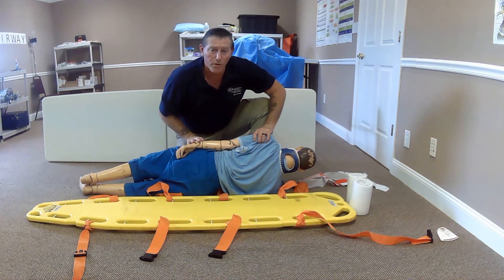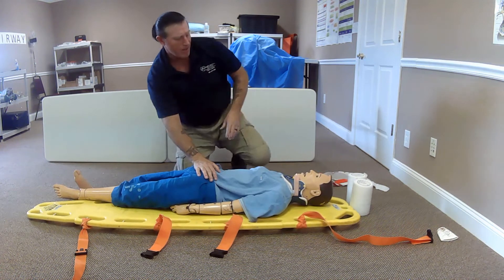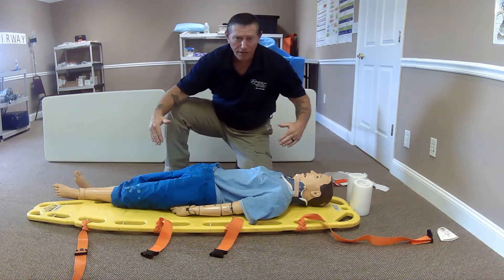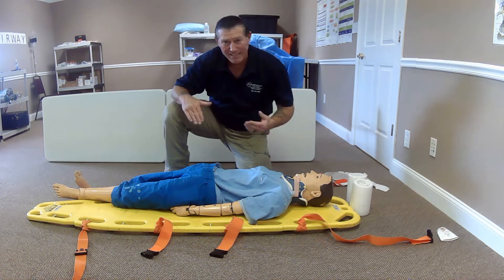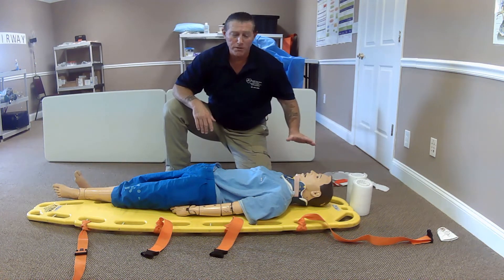I'm going to prepare and move my patient over to the board. Again, on the head person's count, we are going to come down — one, two, three, and go down. I now need to get my patient squared and centered on this board in a proper area. To do that, I'm going to have to move my patient down and then also back up. Again, we're going to do this on the head person's count.